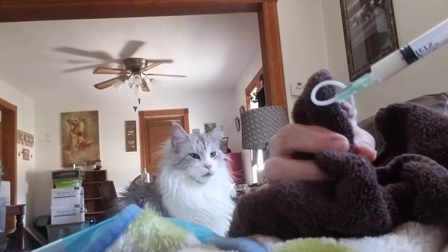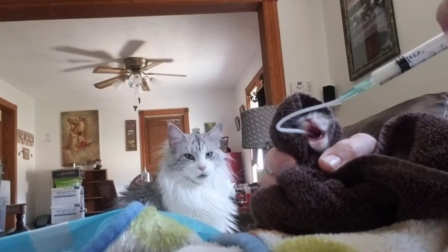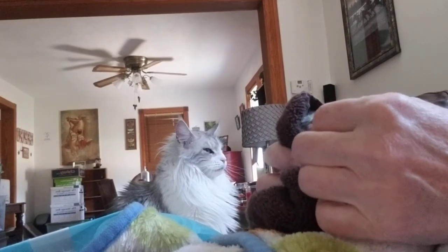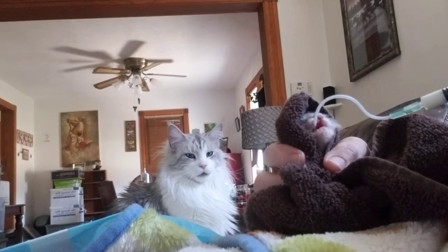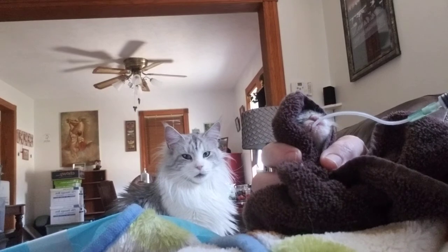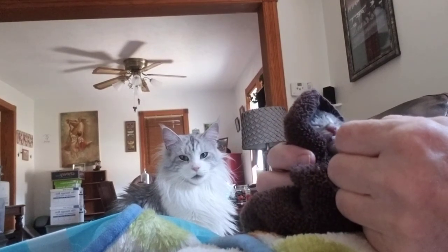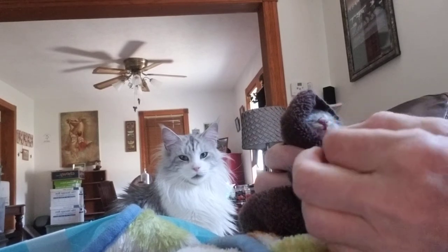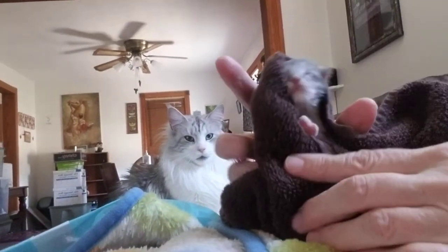Just a little bit. Okay, we'll wait. I wouldn't like it either, little one. Just hold on. Okay. Gotta grow stronger. Placement of the tubing is very important. You don't want to put it in their lung and have them aspirate and get pneumonia. There. And there's two.